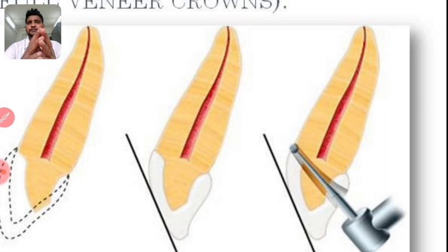Use your loupes and light. Either if you can remove the crown, if you cannot remove the crown, always magnification. And always go slow. Take care of the angle of the tooth. Use a microscope if you have. If you don't have, it's okay to refer out. It's okay to refer these few cases out, man.